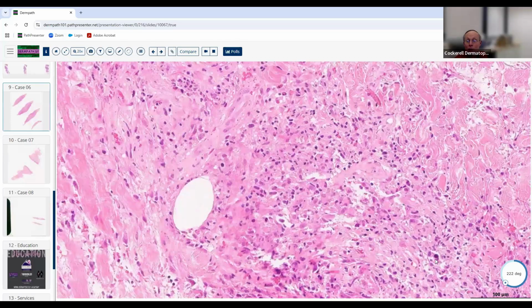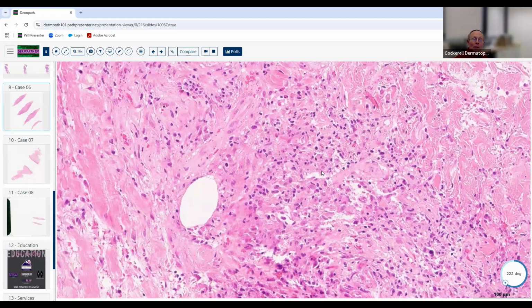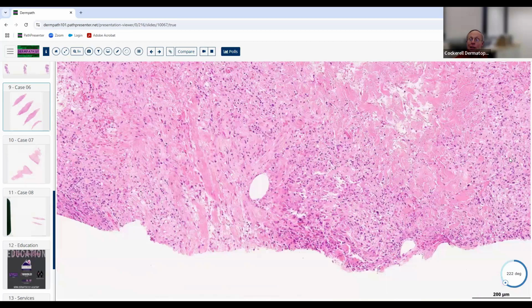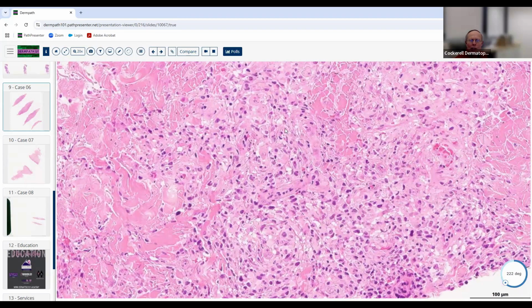I agree. There are a lot of these atypical cells. Perhaps something infectious. Okay, an infection, possibly. That's one thing. Maybe infection with some reactive atypia. That's one possibility. What about this field right here?